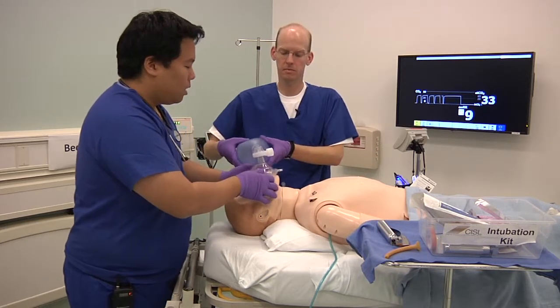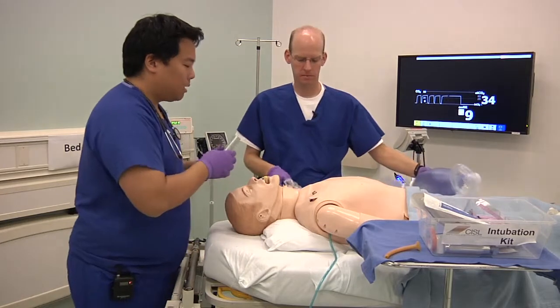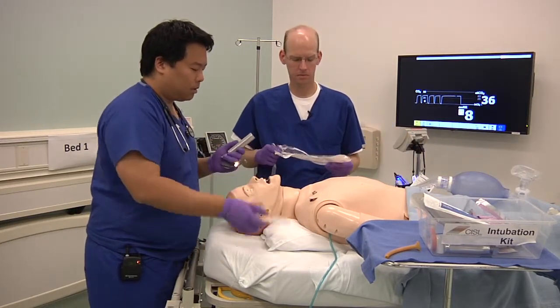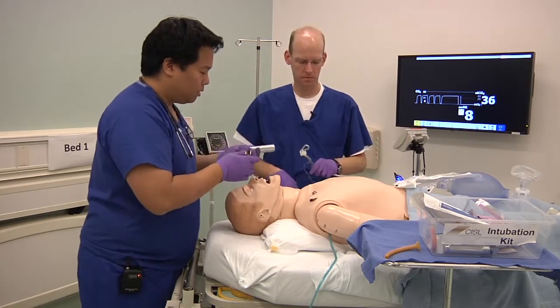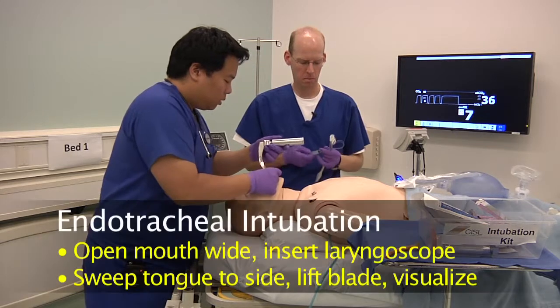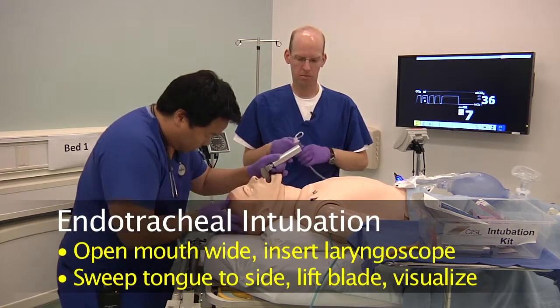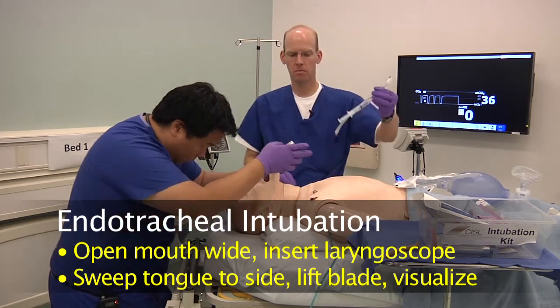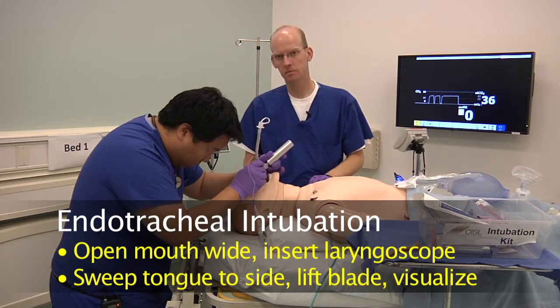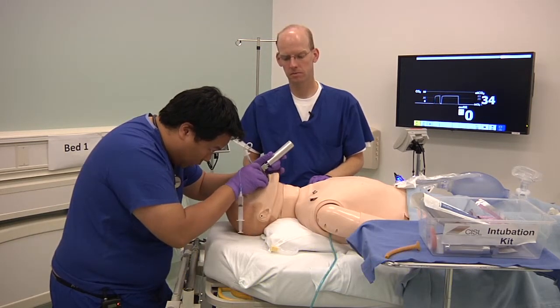Okay, so now when you're ready, you can perform endotracheal intubation. As I mentioned, the height of the bed facilitates this. We're not going to go into all the steps of it today. That's really beyond the scope of this tutorial. The key, though, is to really open the mouth widely, start from the side, and then sweep the tongue out of the way. Tell people what you're seeing. I have a grade 1 view. And when you have the grade 1 view, don't look up to see where the tube is. Someone will hand it to you. And keep that visualization on the glottic opening.